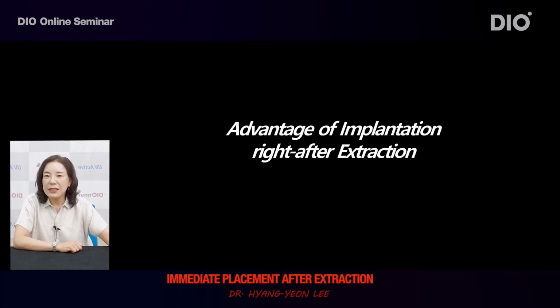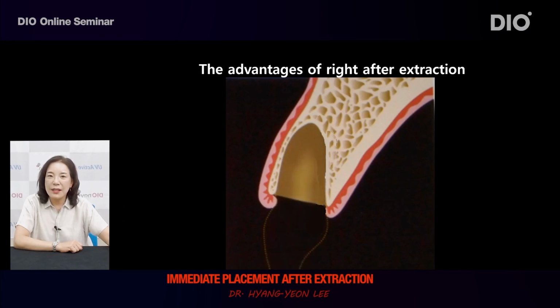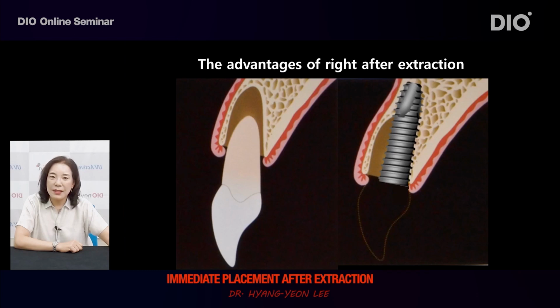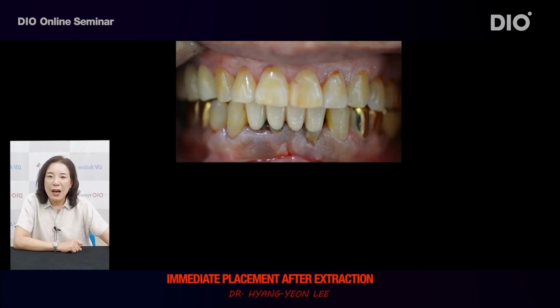I will explain the advantages of immediate placement after extraction first. Immediate placement after extraction refers to placing implant in the location where the tooth has just been extracted. I will examine the advantages of immediate placement after extraction from various aspects. First, patients are highly satisfied with the aesthetic aspect of immediate placement after extraction because implant is placed along with temporary prosthesis after extraction at the same time.